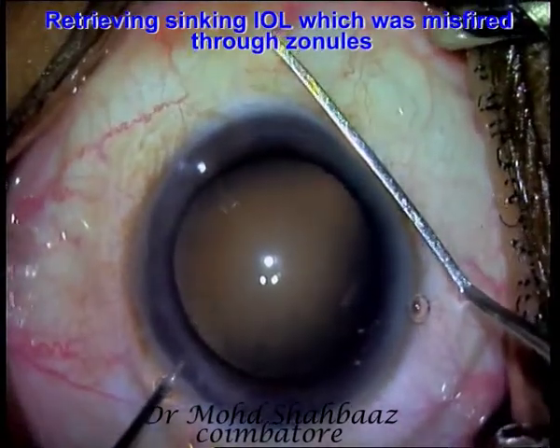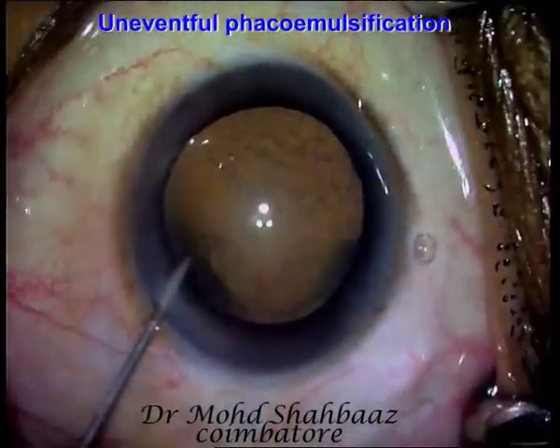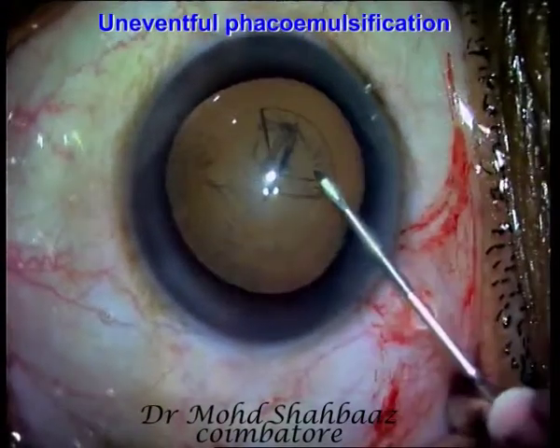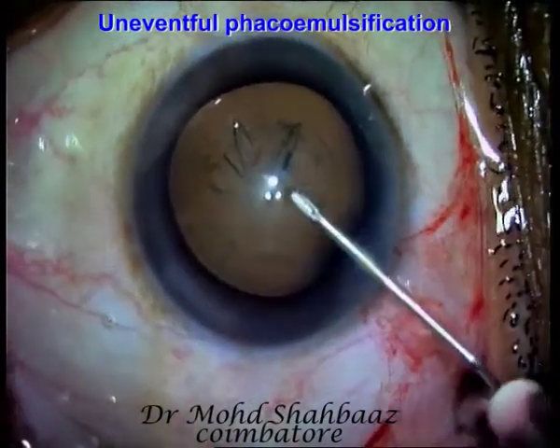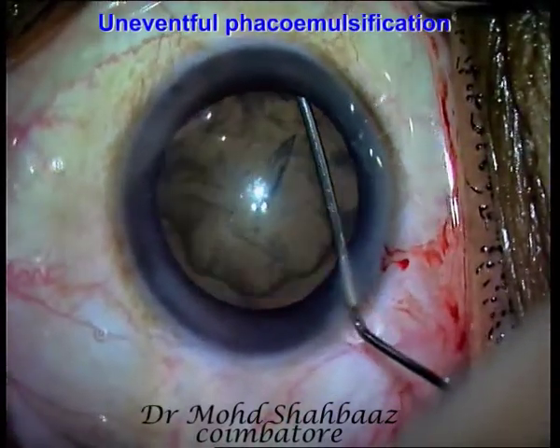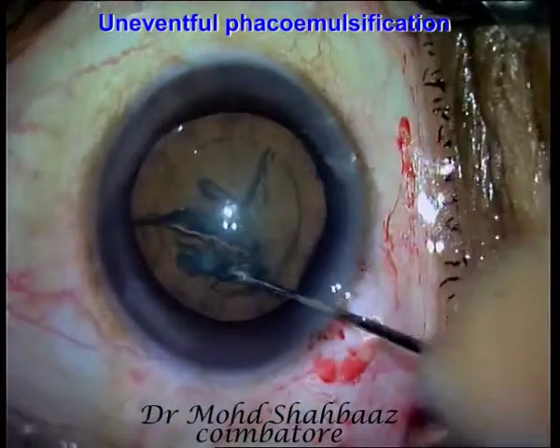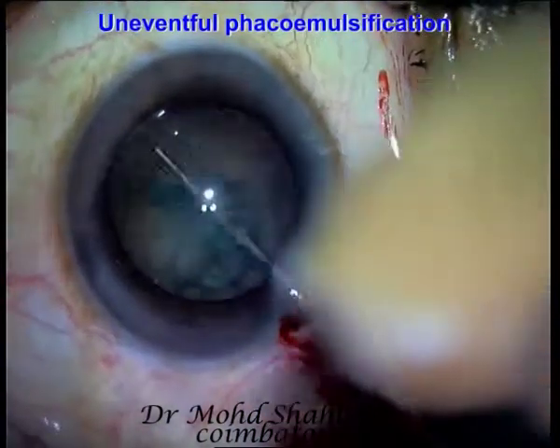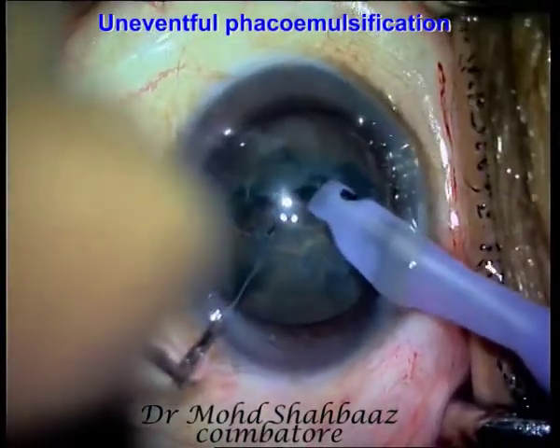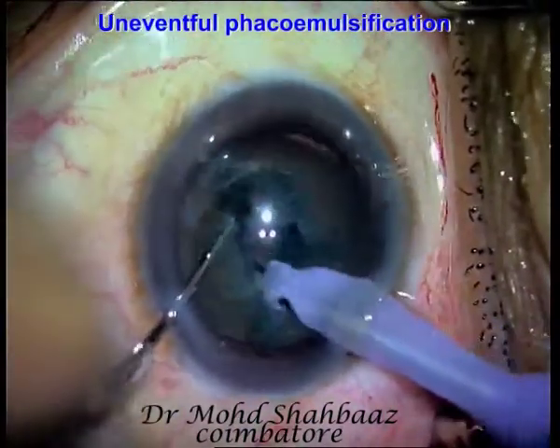This is one rare condition in which, after uneventful phacoemulsification, while implanting the IOL, it went through the zonules into the vitreous cavity. In this video, I am going to show the retrieval of the lens by doing a posterior capsulorhexis and re-implantation of the lens inside the bag.